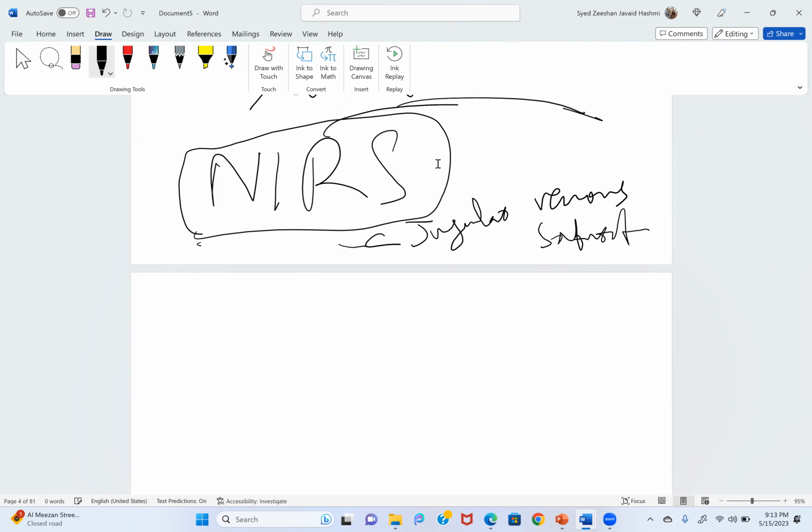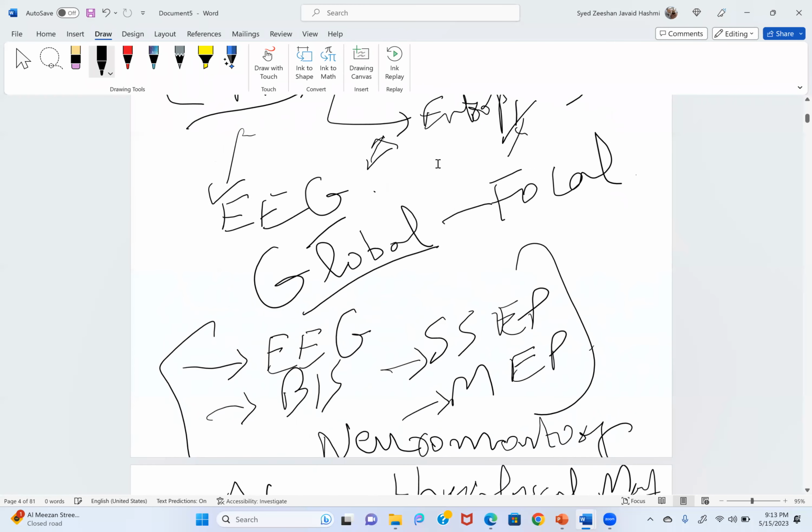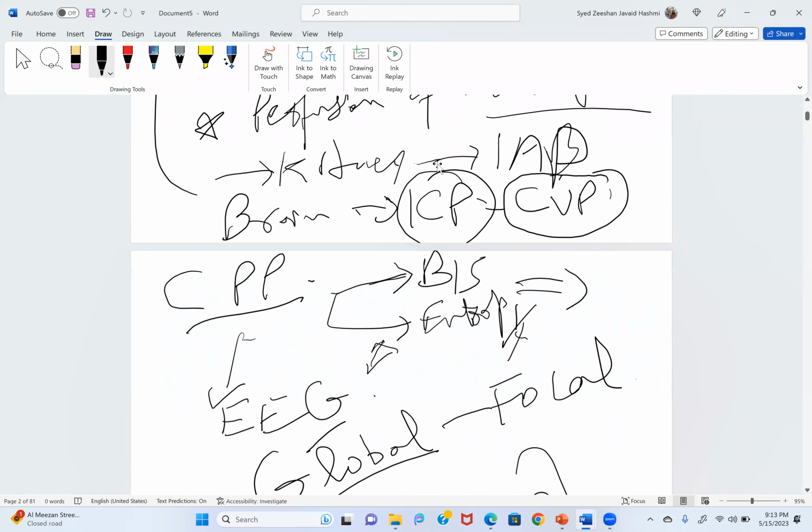At the end of the surgery, of course, we will have certain things, as we said about ICP. So ICP usually will be monitored with clinical signs and symptoms. Not really in every case are we monitoring ICP. If we want to measure the ICP, it will be either an epidural bolt or a ventricular bolt by which we can measure or transduce. But usually the clinical signs and symptoms will tell you about this.